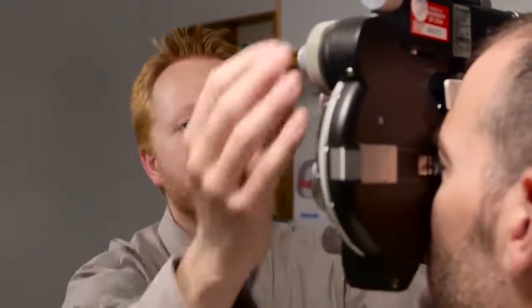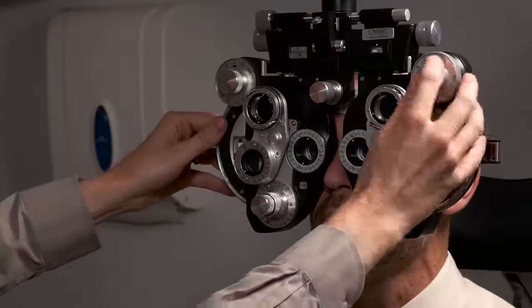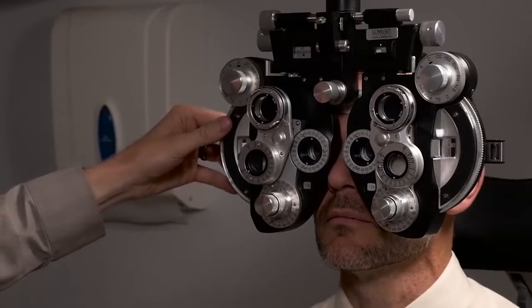We're going to start with the right eye and then go to the left eye. You turn this knob so it reads OC, that means to occlude the left eye. So currently both of his eyes are open, but he can only see through his right eye because the left eye is occluded. I'm going to blur the patient so that the letters are very blurry. Based on previous readings, I already have an idea of roughly what the prescription is, but I'm going to start by making his vision very blurry in the right eye and have him tell me as soon as he can read the letters, even if they're kind of blurry.